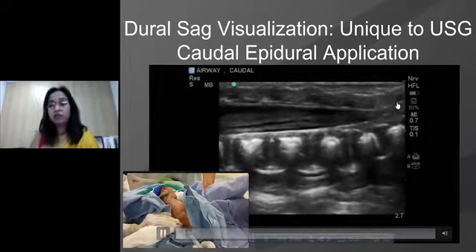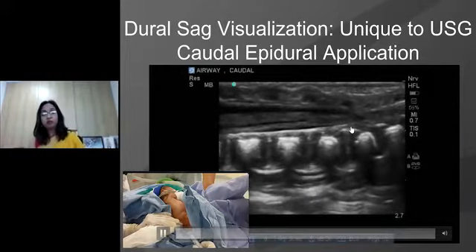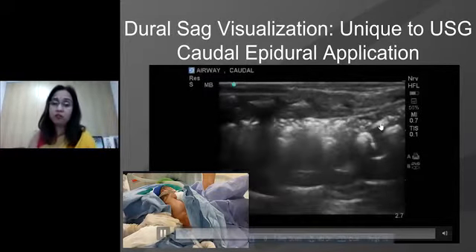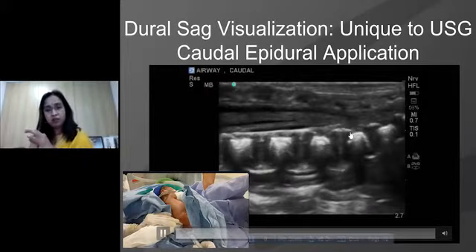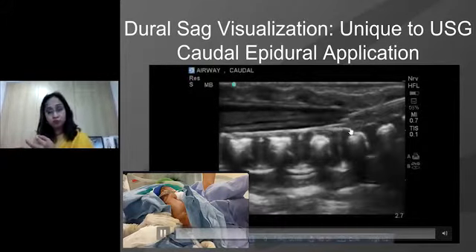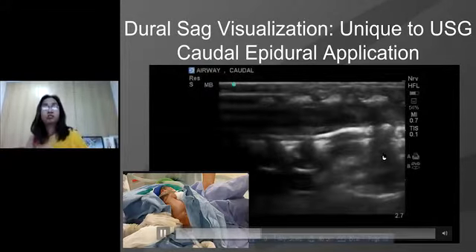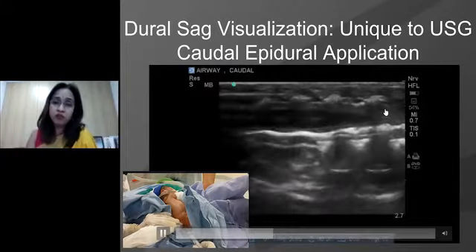So this is the filum terminale. I'm going to see the needle walking in inside, and this is our baby. This is the conus. We should not be puncturing the conus. I've injected, but I can see that there is a tinge of air, which along with the local anesthetic, the air might have been in the hub of the needle actually, and I'm still in the epidural space, which is a bit anterior. We would like to be in the posterior epidural space if possible, and that is how the injection would be conducted.